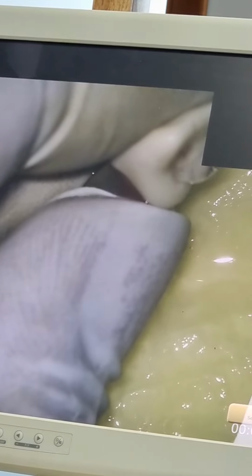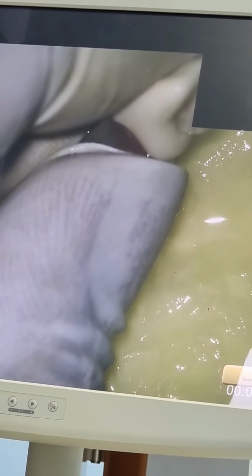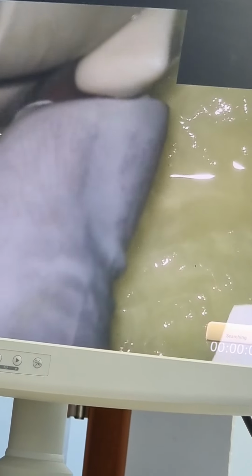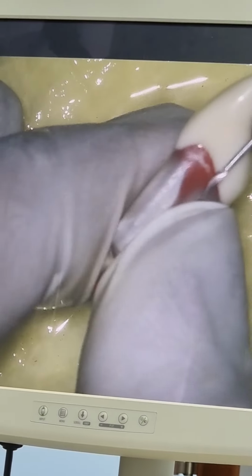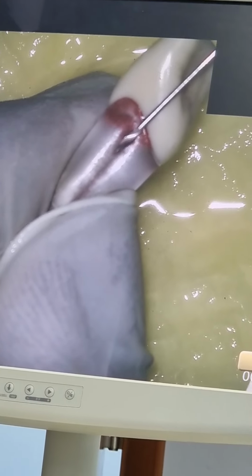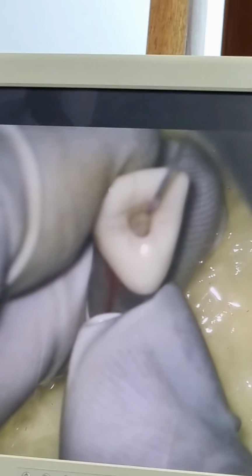Then, I have used size 3 more coronally. Then I will change my Gates Glidden to size 2, one size smaller, and go more apically, at the junction of cervical to middle one-third. And the rules of motion are the same.